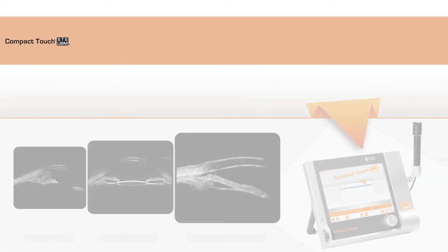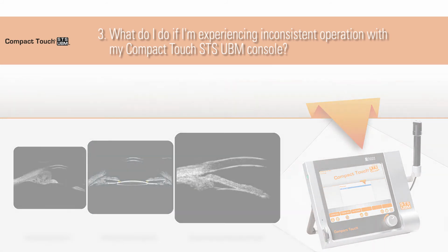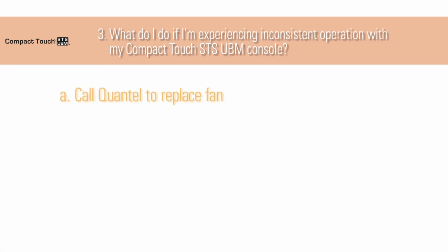3. What do I do if I'm experiencing inconsistent operation with my Compact Touch UBM console? In this case, the CPU board is likely overheating, and a fan assembly should be installed by a Quantel technician.